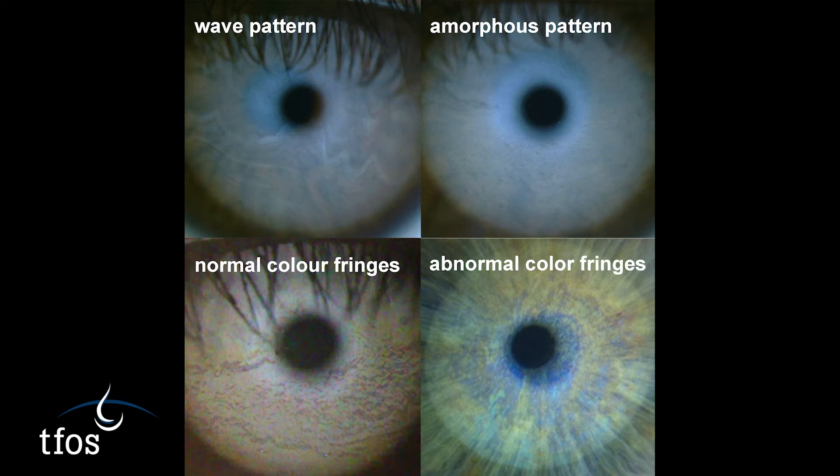First-order coloured fringes are visible when the lipid layer is approximately 100 nm thick. Meibomian gland dysfunction can adversely affect lipid quality and quantity and result in abnormal coloured fringe patterns with rapidly changing bright colours. This is thought to signify clumps of lipid floating amidst little or no lipid cover.